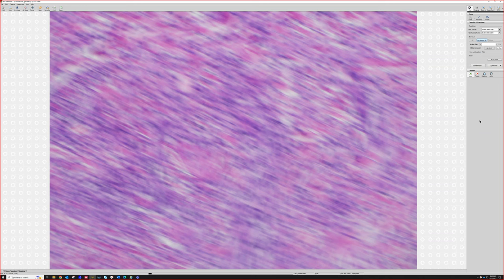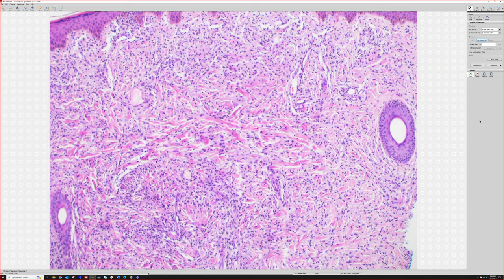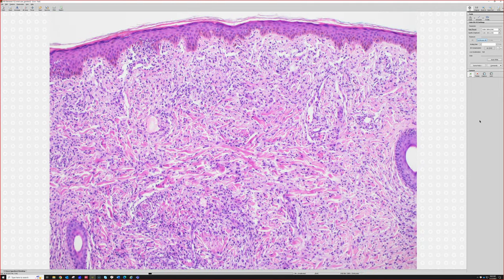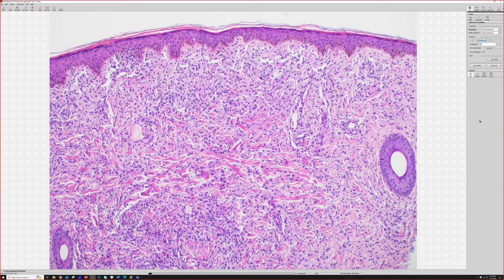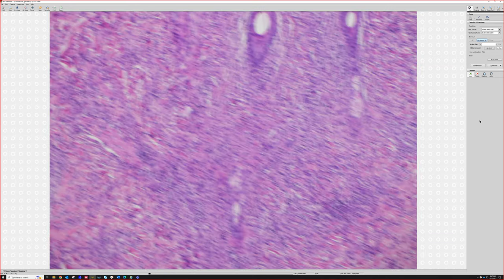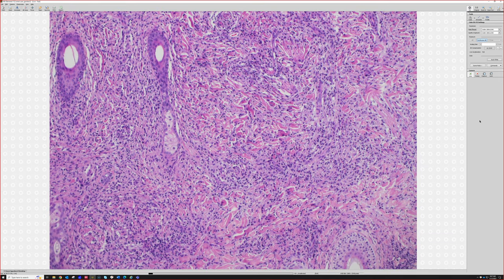Well, I'll tell you this. When I see an infiltrate of cells in the dermis, look, a lot of the dermal collagen is still there. It's kind of altered, but the cells are kind of filling in the spaces between the collagen. So right away, that makes me think of either a hematopoietic process, like a lymphoproliferative process, or an inflammatory process, right? It makes me think of where you got some type of white blood cell, because white blood cells don't stick to each other. They're able to float through the blood, and they're also able to just kind of fill in all the spaces in the tissue without displacing the normal structures, right? See, the normal adnexal structures are still kind of there. It's just everything's filled in around them. So right away, I'd wonder, is this like leukemia cutis or lymphoma, or is this some sort of histiocytic proliferation?